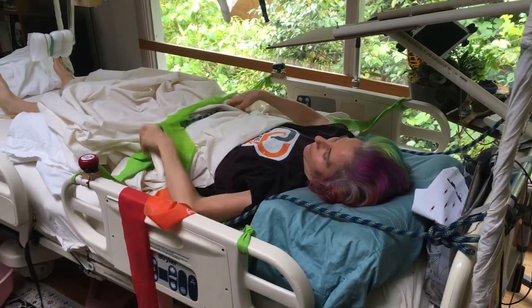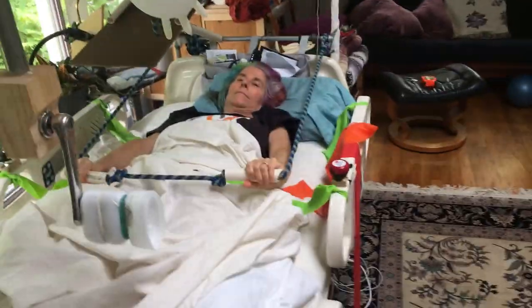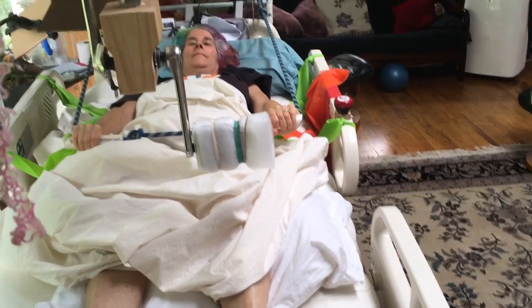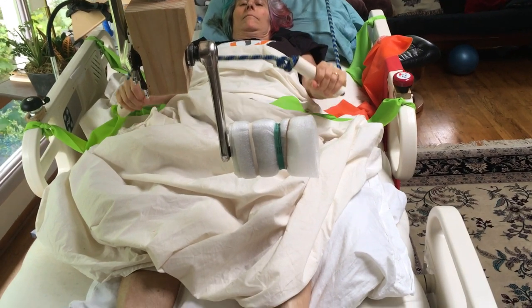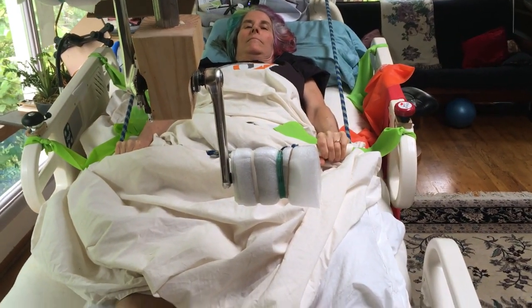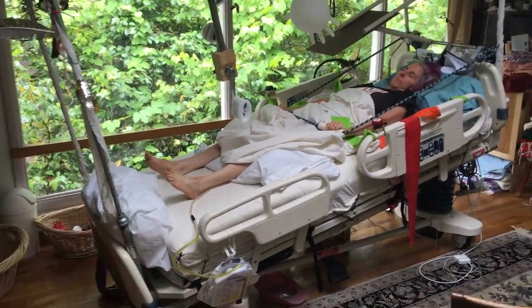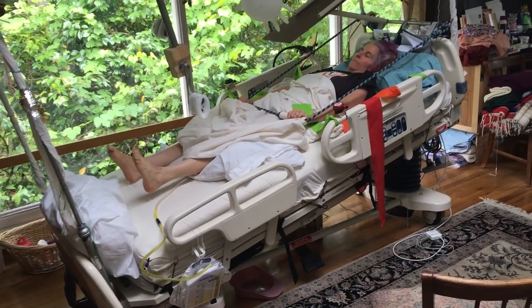This framework allows a patient who's bed-bound to remain in bed productively. Lori also wants to demonstrate the rope system — she has two handles. Lori can't put any pressure on her back, but she can put tension on it. We can use the Stryker bed to elevate her head up to 12 degrees, having her apply compression on her arms, which puts tension on her back. Given her broken back, that's an acceptable mode. Going to 12 degrees gives her the change in blood pressure between head and feet, reminding her body how to maintain blood pressure stasis when she hopefully becomes upright soon.